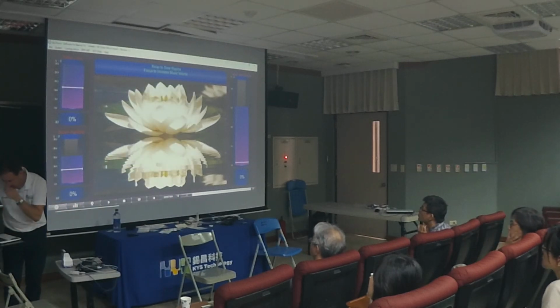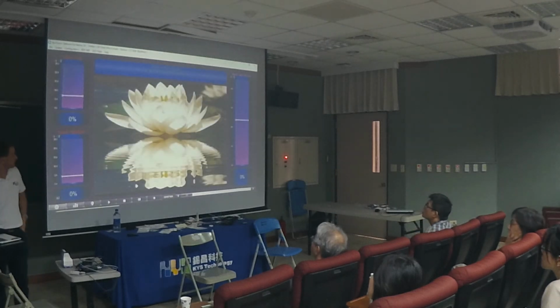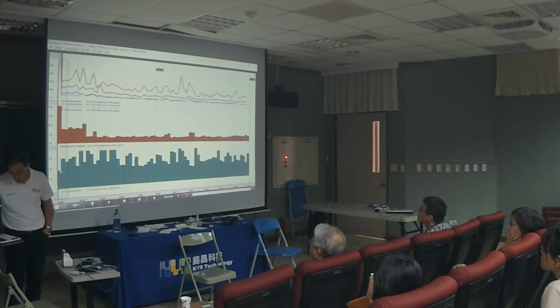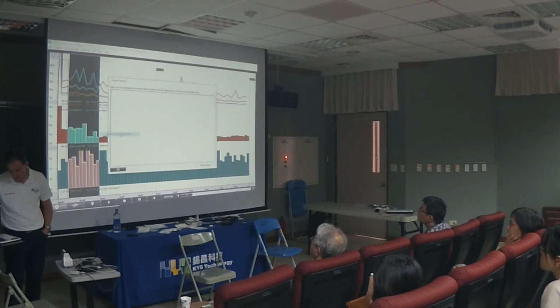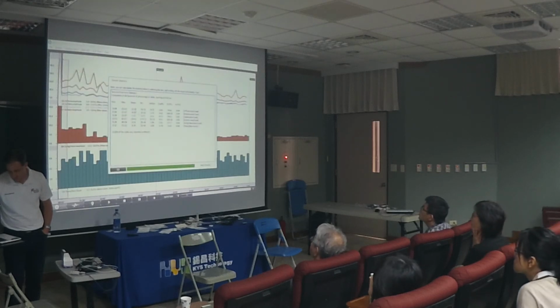Let's open a session. All right, so this is a CZ SMR training, basically. So let's assume that this is the baseline here, right? So I did the baseline, and the theta was at 13, the alpha was at 6, the beta was at 25, and so on and so forth.